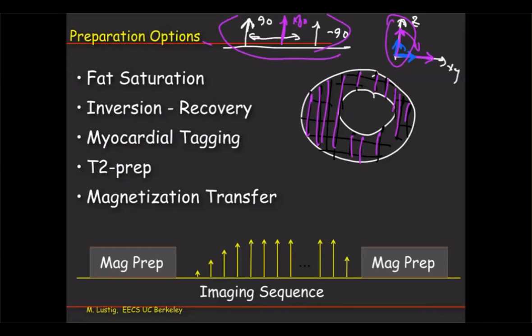It's great. But what you heard, that tone comes from the TR, like how fast these are happening. And then mag prep, mag prep, mag prep. And that's why it sounded like that. Otherwise, it would have just sounded like the TR. But because you have these preps, it sounds different. You want to hear it again?